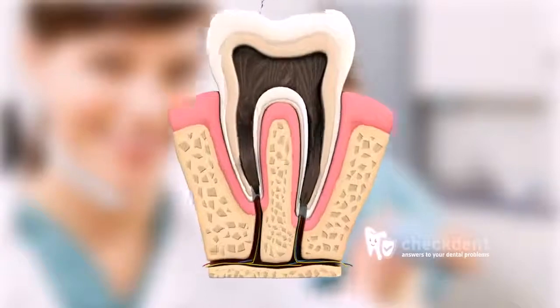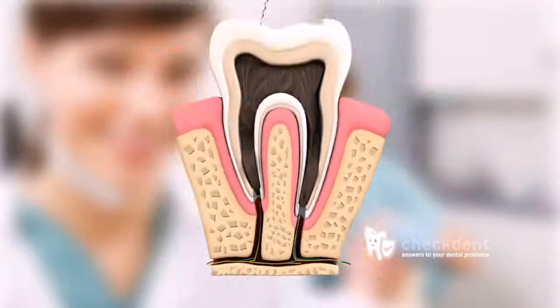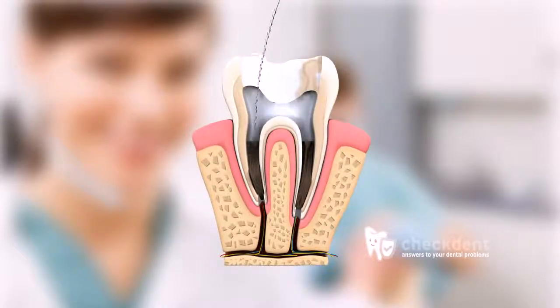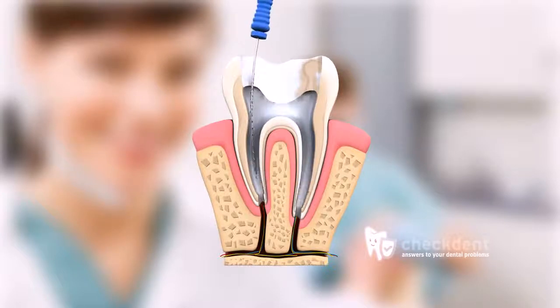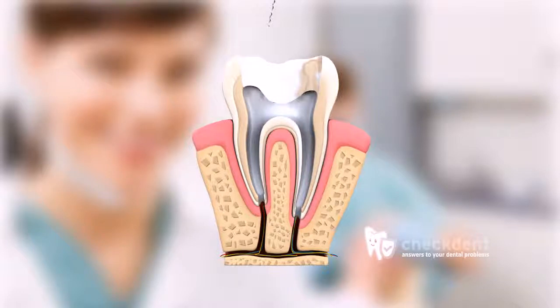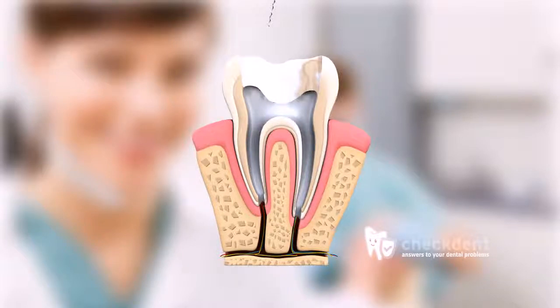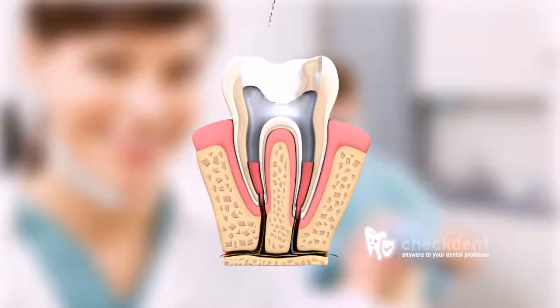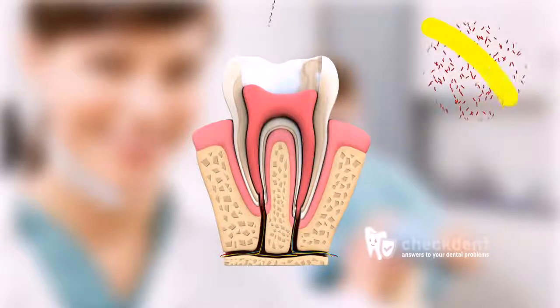The tooth is connected to the bone through numerous small canals at the end of the root. The objective of a root canal treatment is to completely remove the destroyed tissue, which may also be infected with bacteria in some cases, from the interior of a tooth. This way, the infection is prevented from spreading to the bone. Since complete cleaning of the interior of a tooth is never 100% successful, the dentist attempts to close the pulp cavity and the root canals tightly with a special compound so that any remaining bacteria don't have space to multiply.